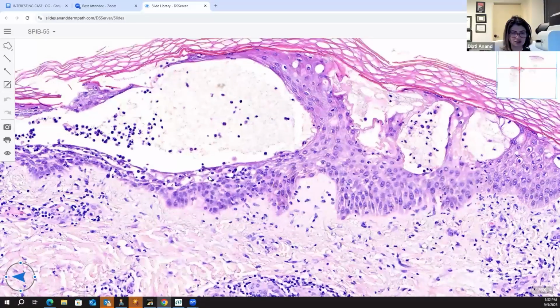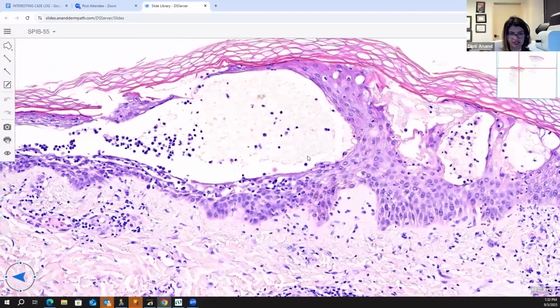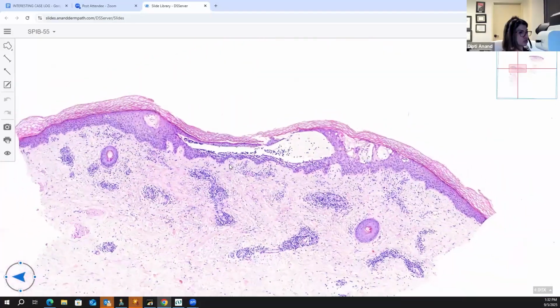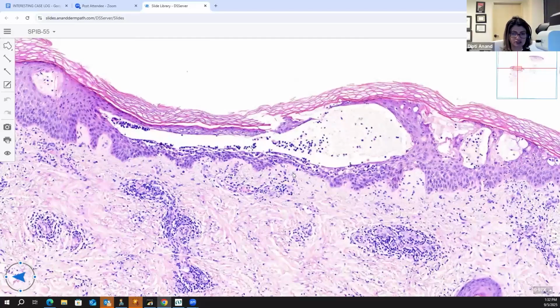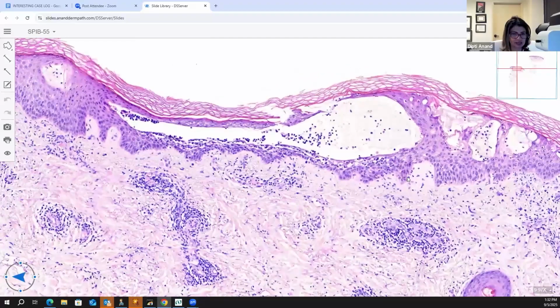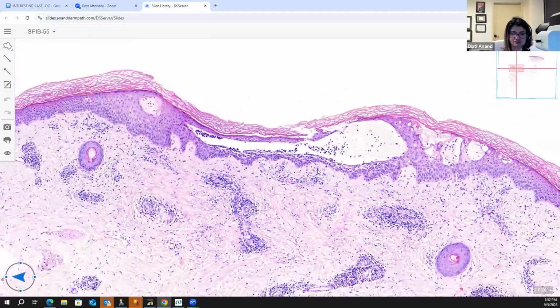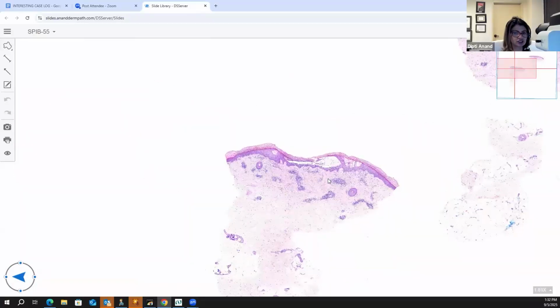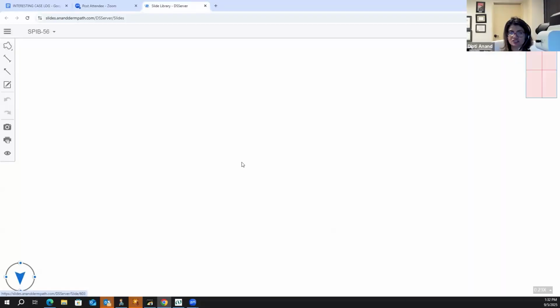Okay, so I thought this was maybe like an acute spongiosis. Yep, so everybody gets this to be acute spongiotic. I think this is pretty simple. Just notice that paradoxically, sometimes in acute spongiosis, the stratum corneum can remain intact, which is fine. It doesn't have the crust, but this is an acute spongiotic dermatitis. So it would be like a contact, or basically you need to recognize this to be eczema because of the spongiosis and because of the superficial nature of the infiltrate. Okay, good. We have the next one, which is 56.